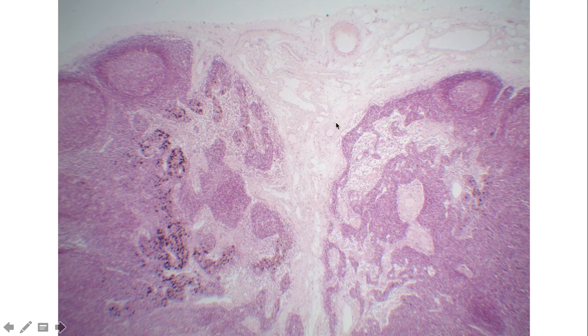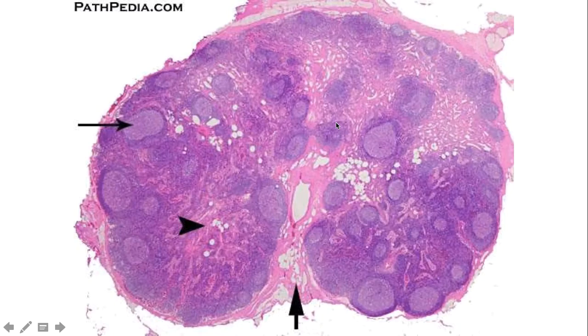And so again, just going back to this very first figure, just to review here, here's our lymph node. The outer area is the capsule. It's a dense irregular CT. There are some areas where this capsule dips down, and these little dips in here between these follicles are going to be referred to as the trabeculae.